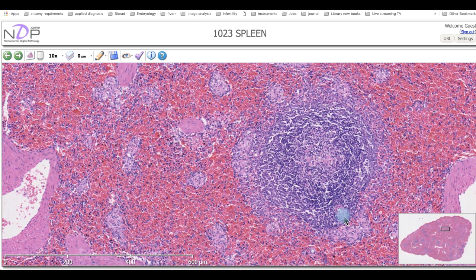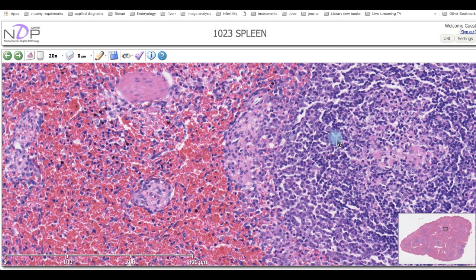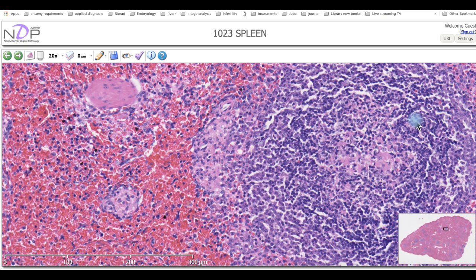The lymph nodule contains this central arteriole or nodular arteriole, and this can be easily differentiated from the nodules found in the lymph node. In the lymph node, they don't have this central arteriole. If we increase the magnification of these nodules, we can see they consist of lymphocytes. All the cells found here are lymphocytes, and the other cells in this area are the cytoreticulum, which is the supportive tissue of these nodules.